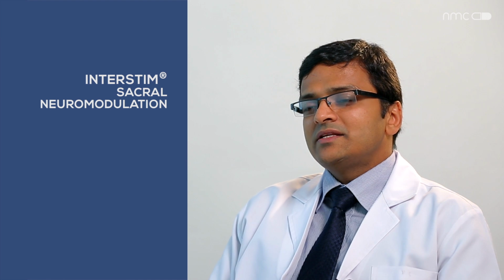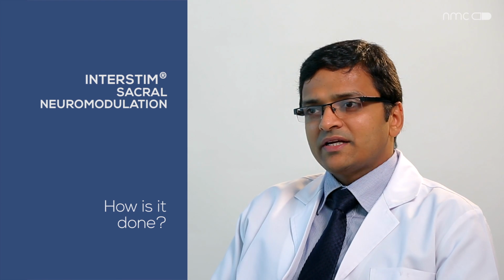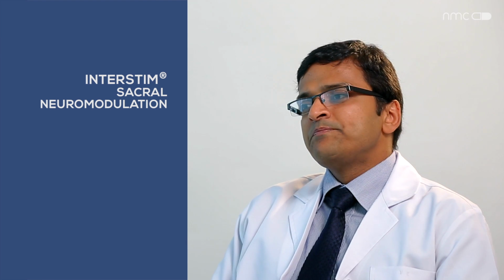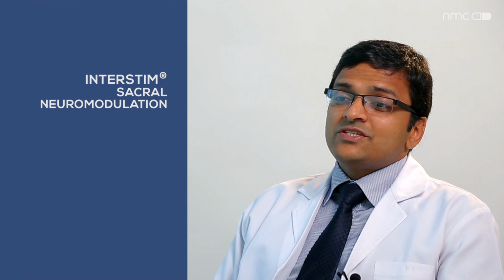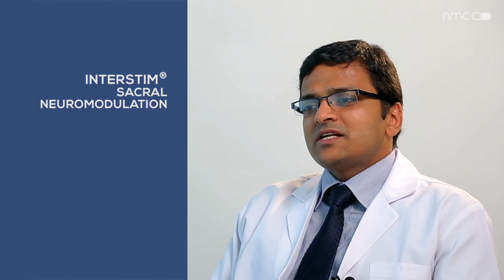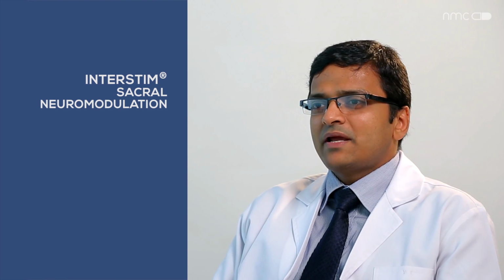It is in that the same lead is used, which was used for the external pacemaker, and by a small surgical procedure, a small battery with a special electric signal device is placed inside the buttock, and it is connected internally with that electronic electrode. At the end of the procedure, the patient is given a remote control, which is operated by wireless means, by which the patient can switch it on or off or change some minor settings. It starts working from day one it is implanted, and the person will have the benefit from day one, although there will be some adjustment issues like pain or discomfort which will take some time to adjust.